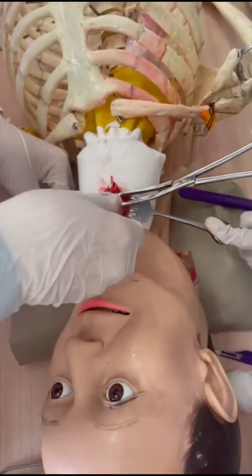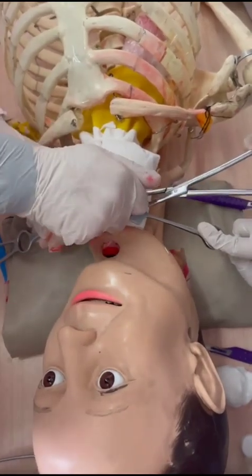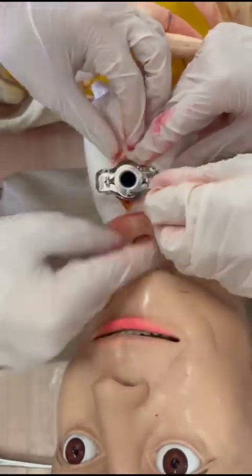The skin incision is closed loosely if necessary. The tracheostomy tube is secured in position with sutures, and the connector is ensured to be in a neutral position and not pulling on the tracheostomy tube.